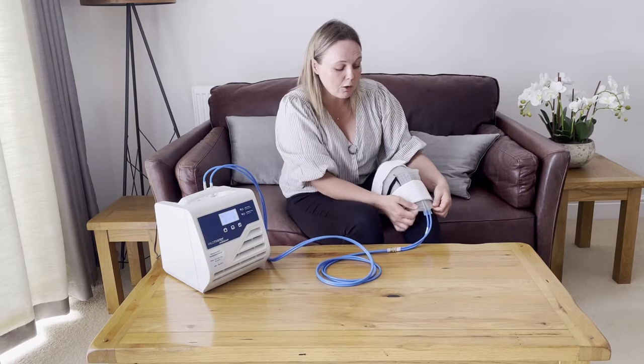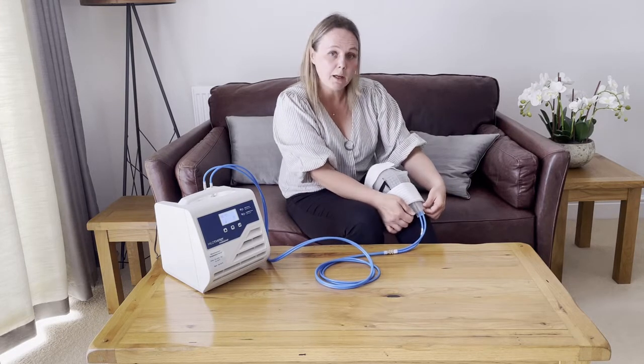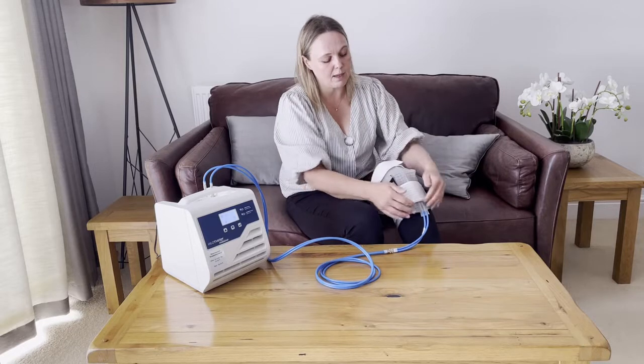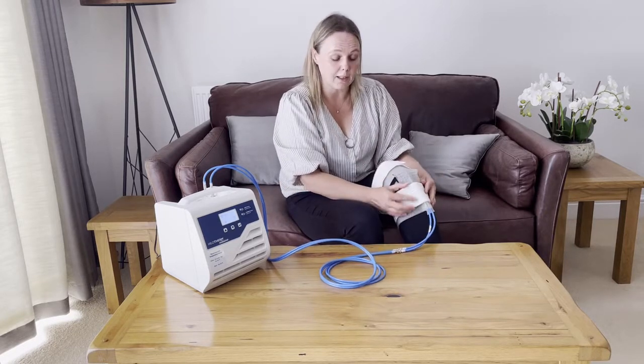I always recommend checking that the water is circulating all the way around. You can do that by pressing on both sides of the blue tubing, just on the cuff near the blue tubing, to check that the cuff feels inflated on both sides. Make sure the straps are not fitted too tightly — just enough to hold it in place.